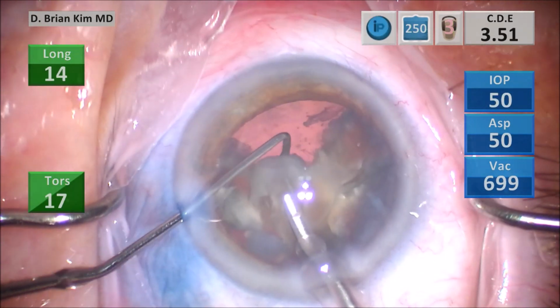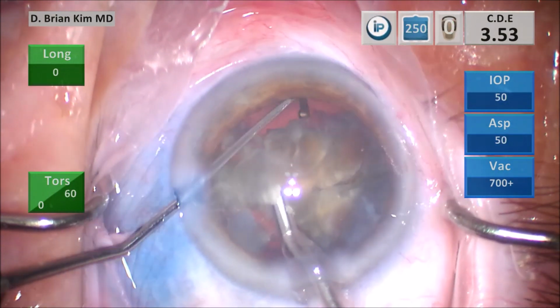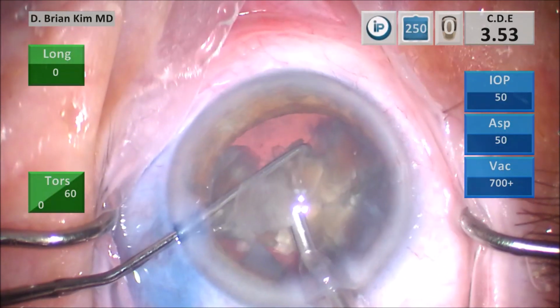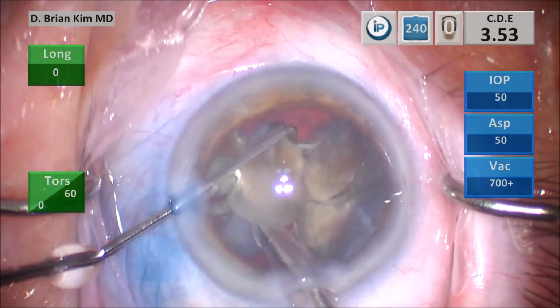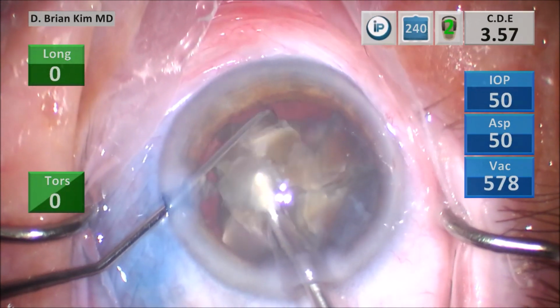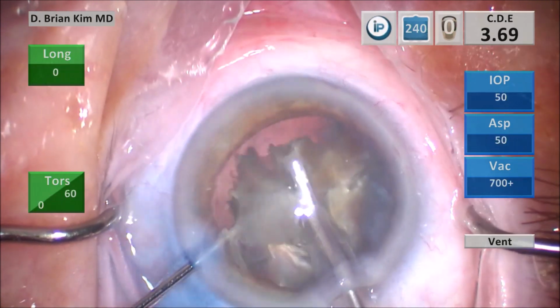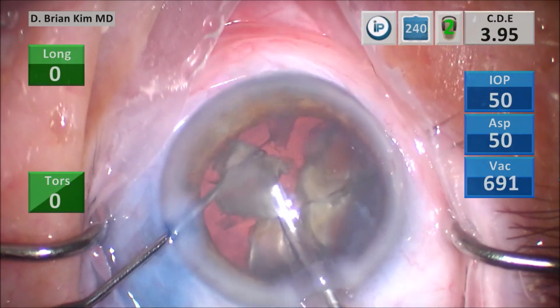Using a little bit of vacuum to position the lens piece, and then sandwiching the lens between the chopper and the phaco tip. What you're seeing there is I'm just trying to position the lens piece right so that it will bisect the lens piece. Because if it's not quite in the right position, as you try to chop it, it'll just kind of move to the side or tiddlywink off.